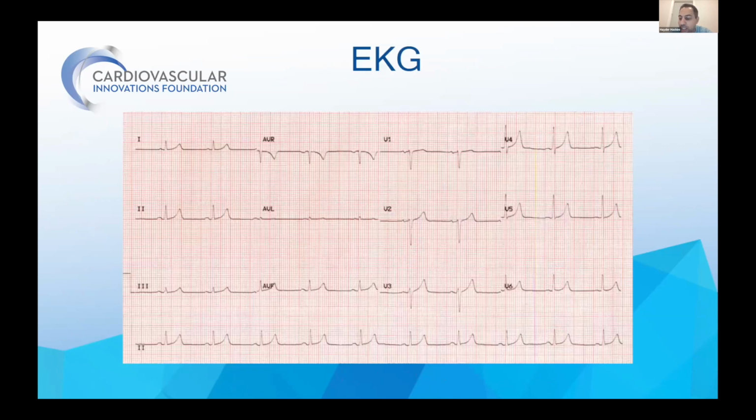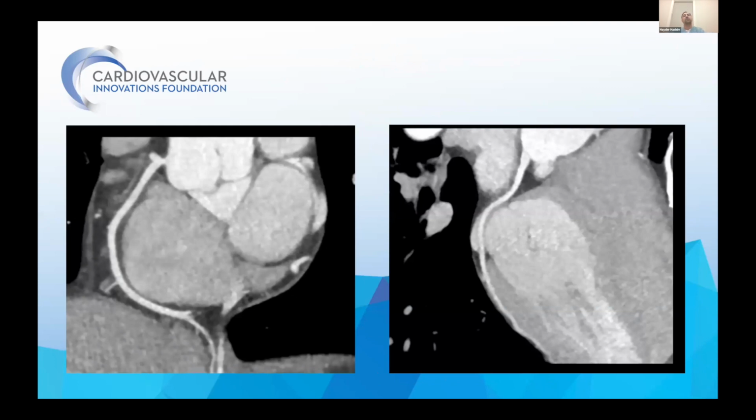This was his resting EKG when he saw his cardiologist. Nothing of significance, and has the same exact EKG when he had the resting pain visiting the emergency room. And as you know, following ISCHEMIA trial, most of our patients nowadays are deviating away from functional testing into more anatomical testing and definition by CT scan.